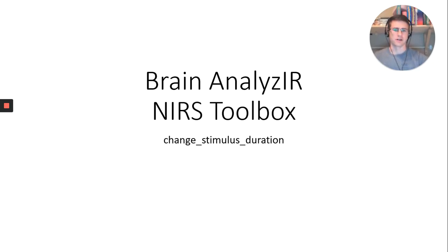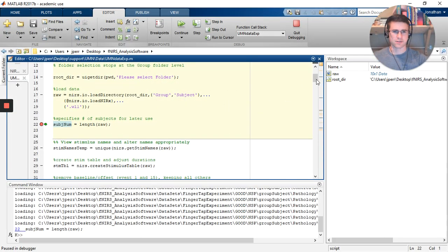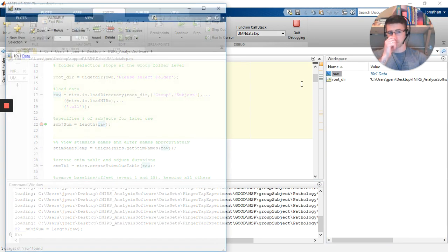Hi everybody. This is a very quick video on how to change stimulus duration in the Brain AnalyzIR NIRS Toolbox. I've loaded a data set into the NIRS Toolbox. I used the loadNIRx function and saved the output as raw. You'll notice I have the variable right here.